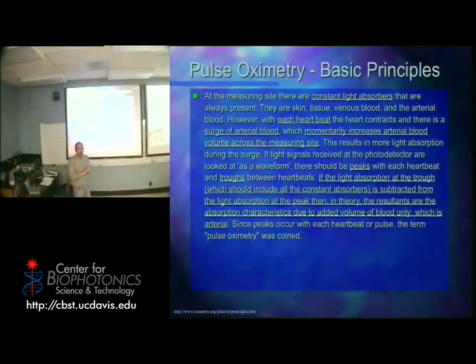So, how did they used to measure it? How do they still measure it at times when they have to? They have to bend back the wrist and they have to get to that artery. Okay, so you can't use one of those wimpy needles that they use for getting blood from your veins. You got to use a thicker needle. Okay, it's got to be thicker because it's got to make it through and not bend. Right? You don't want the needle bending. That's not good either. So you got to get in there.